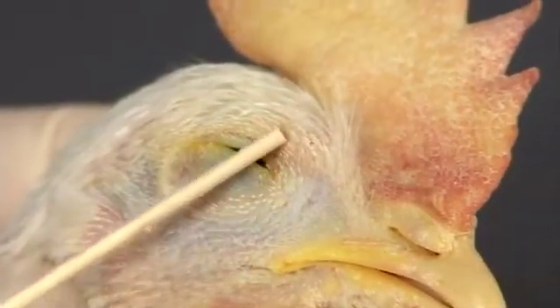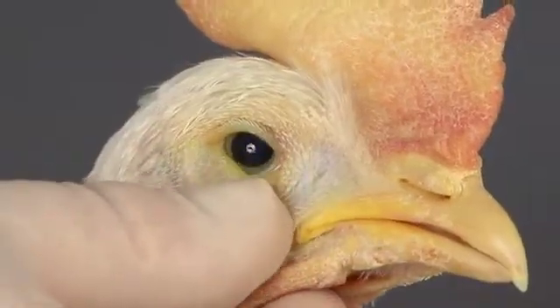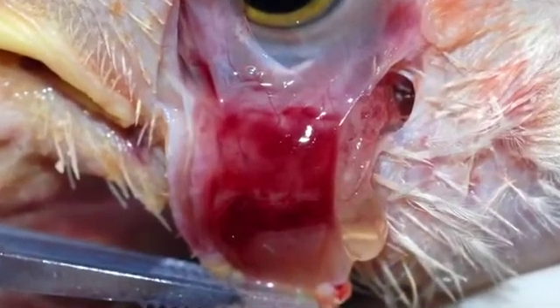Examine the external eyelids for swelling or discharge. Grasp the lids and evert them to visualize the conjunctival sac and membranes. These mucous membranes should be light pink in color and free of any swelling or exudate. Red membranes may indicate inflammation or infection.